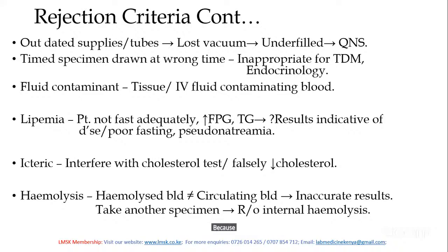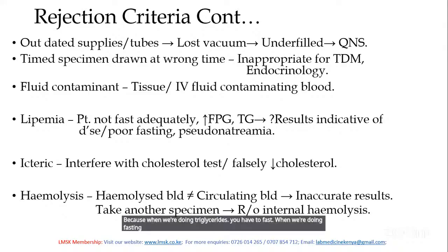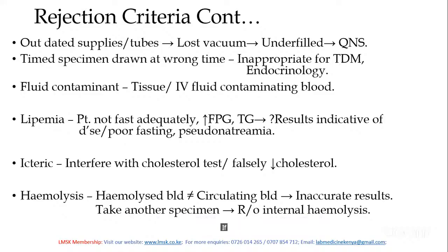Because when we're doing triglycerides, you have to fast. When we're doing fasting plasma glucose, you have to fast. If you don't fast, or do it inadequately, those values will be high. Now, we want to know, is that high value indicative of a disease, or is it because of poor fasting? That's why you should not analyze a lipemic specimen.